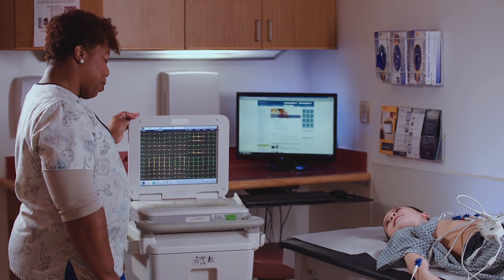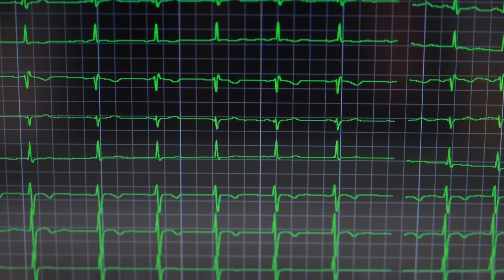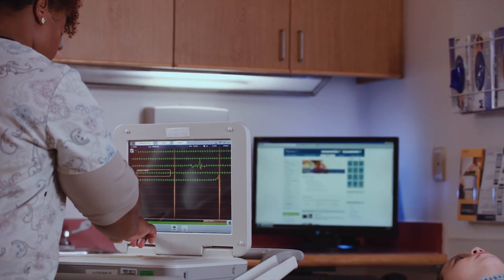EKG stands for electrocardiogram. It's sometimes called ECG. An EKG checks how your heart is beating. During the test, you won't feel a thing.